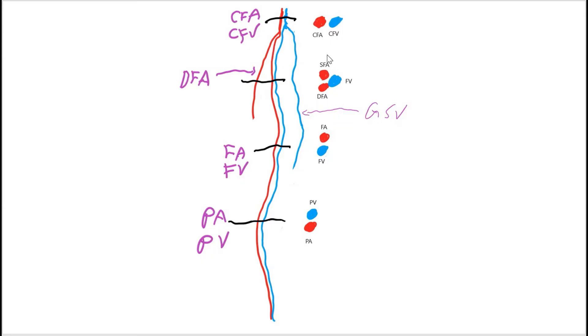Now this one here, this area you have a Mickey Mouse sign. So the top artery is superficial femoral artery, the bottom is deep femoral artery, and the right side is the femoral vein.